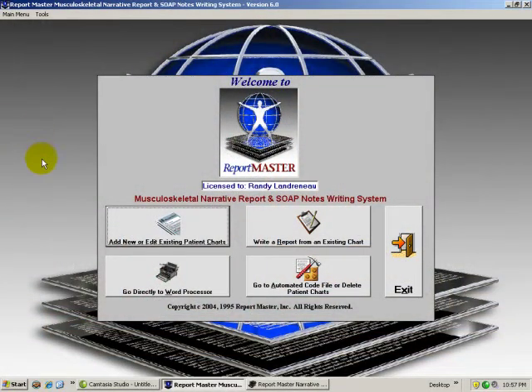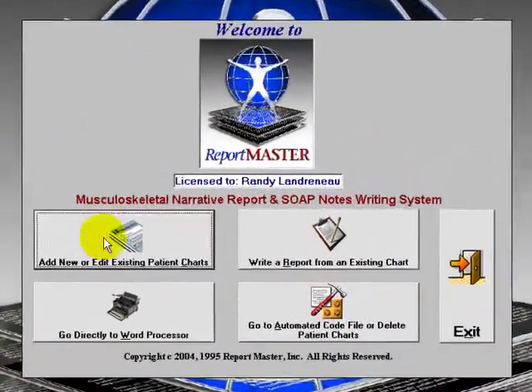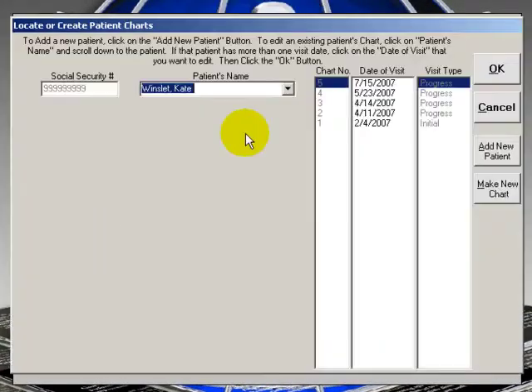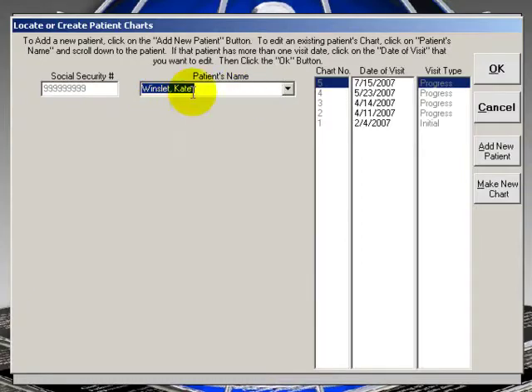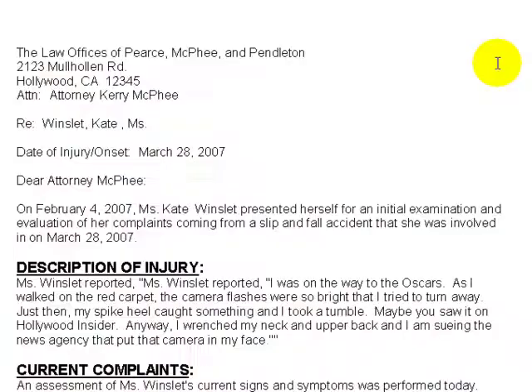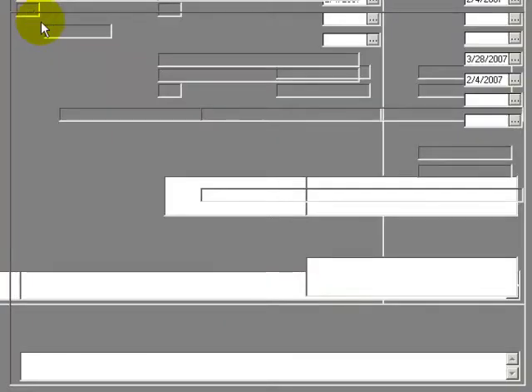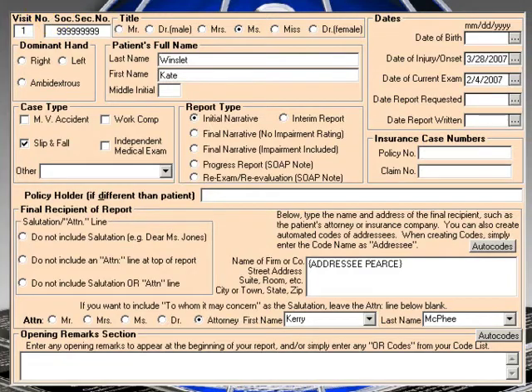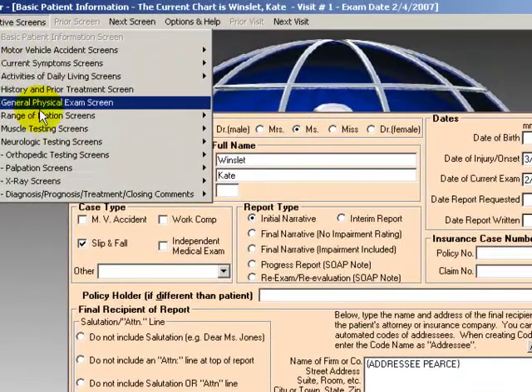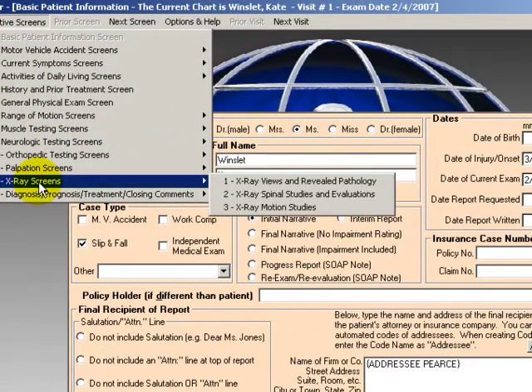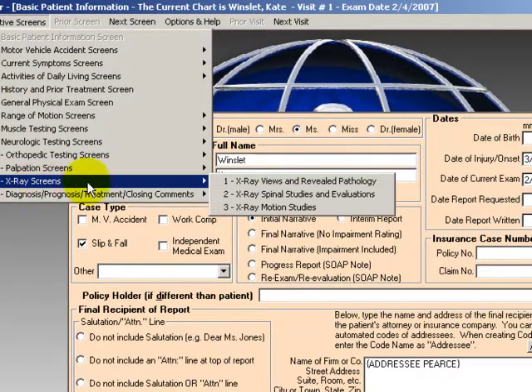We're in ReportMaster Software here. I'm actually going to go into a chart. Here we have a patient. We're going to go to her initial visit. And we're just going to hit the drop down button here for narrative screens and go down to the x-ray screens right here. And we're just going to go to the first of the x-ray screens.